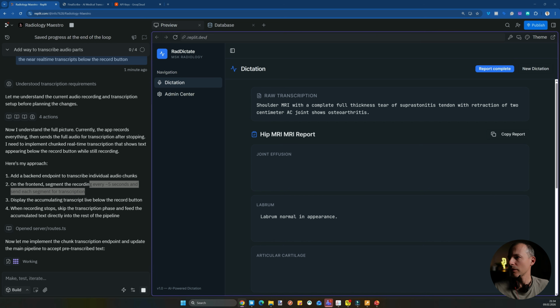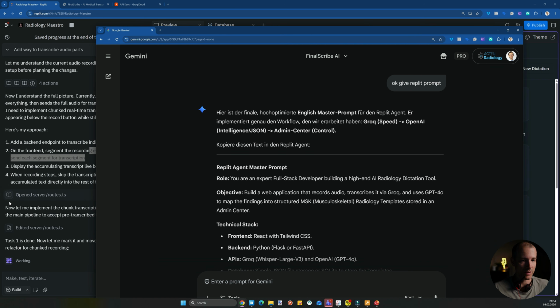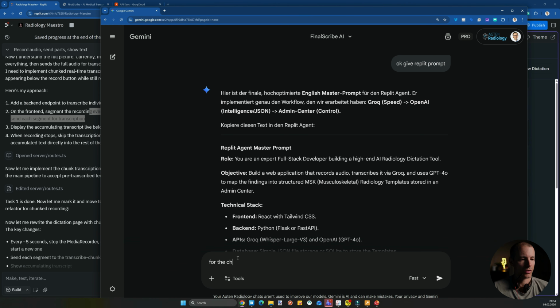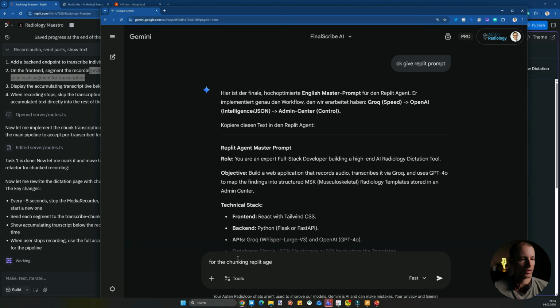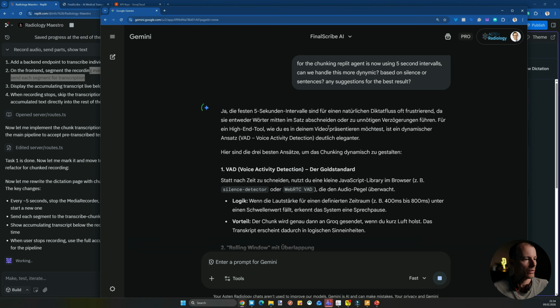So I'm gonna go now and ask Gemini for help. We don't want to discuss everything with the agent because every prompt costs money. For the chunking, Replit Agent is now using 5-second intervals. Can we handle this more dynamic based on silence or sentences? Any suggestions for the best result? So I'm just going to ask what Gemini thinks, and then we see. Now it's entering in German.